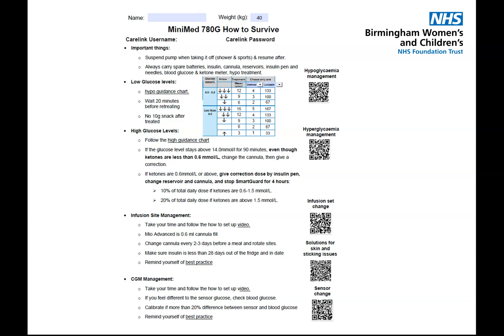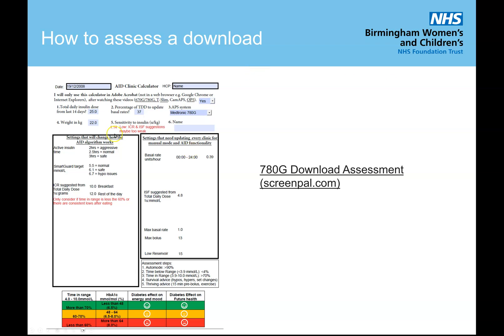On the download tool, you can see what adjusts the algorithm: two hours is aggressive, 2.5 hours is normal, three hours is safe. Target of 5.5 is normal but may cause hypo issues. The suggested carb ratios are based on average insulin sensitivity — but the average person is very unlikely to turn up in your clinic, so apply your clinical judgment rather than doing what the computer says. Look at the readings, determine what you think is right, and use that as a guide. It's also important to update the basal rates, sensitivities, and max basal rates in the background, then follow the assessment process.